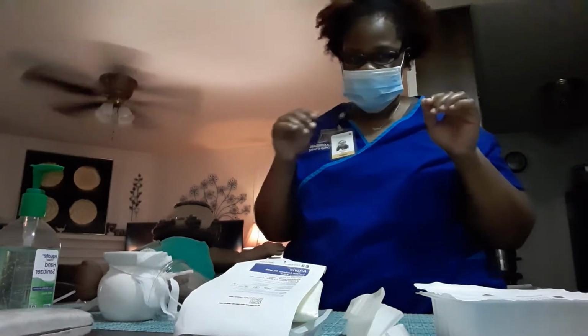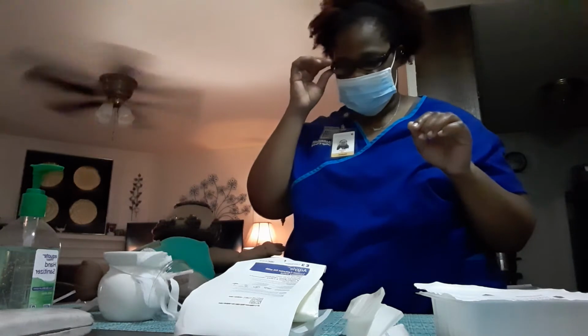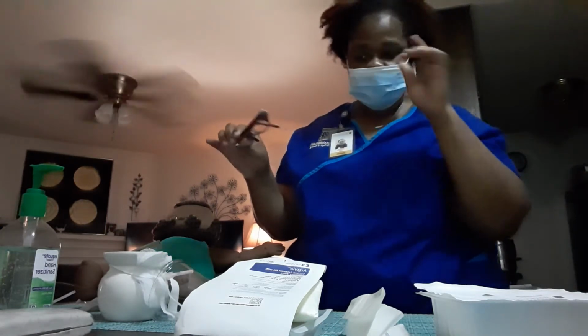Well, actually, let's go ahead and put this on. We're going to close this back. I'm going to pretend I didn't open it yet. I'm going to put on my protective eyewear. I'm going to see if I can put it on without it fogging up my glasses too bad. Okay, I'm going to have to take these off for now because it's warm in here or something. It's causing me to have fog. So I have my protective eyewear and my glasses on.